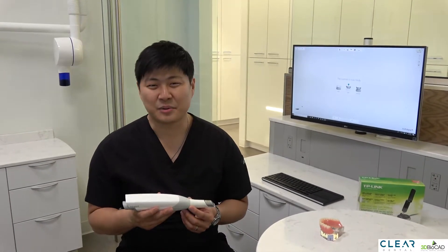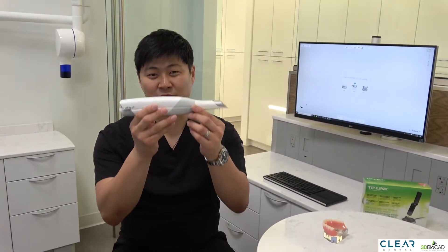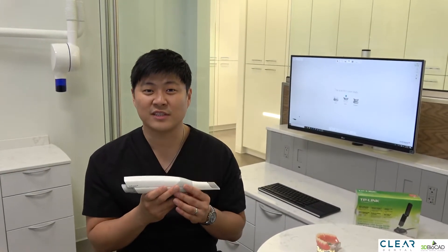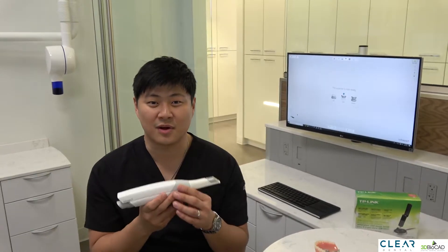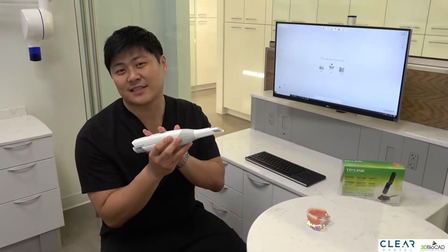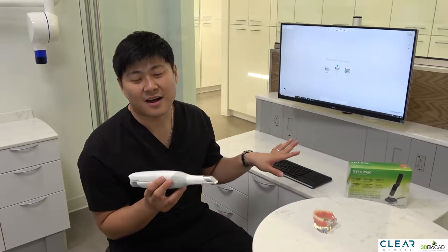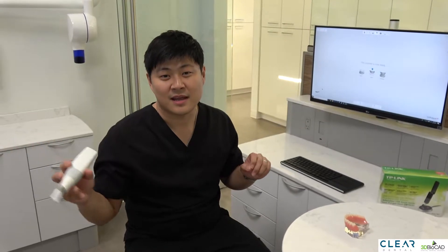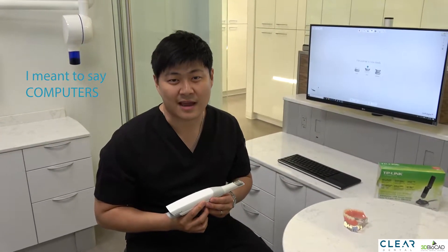Hello everyone. Today I would like to make a video about our TRIOS and how it's connected to our computers. We just received our wireless TRIOS not too long ago and we're very excited about it. But before we talk about how it's connected to the computer, let me talk about how our monitor and TV screen is connected for our TRIOS scanner.